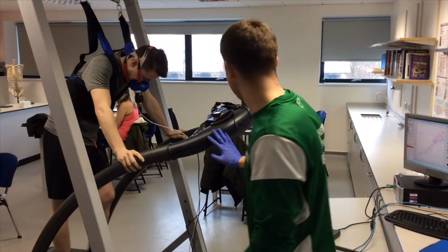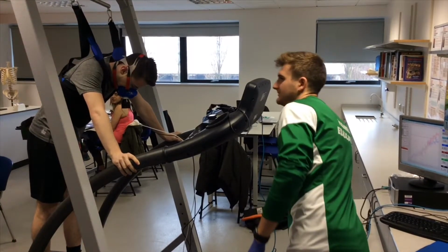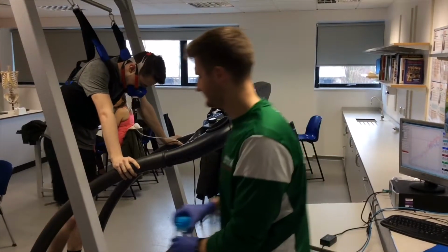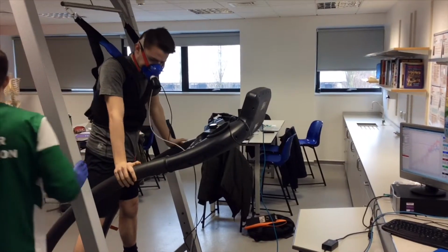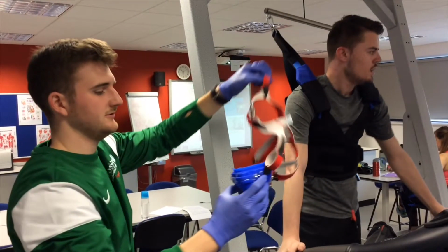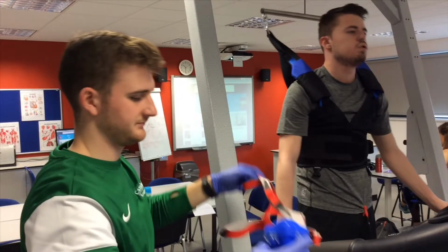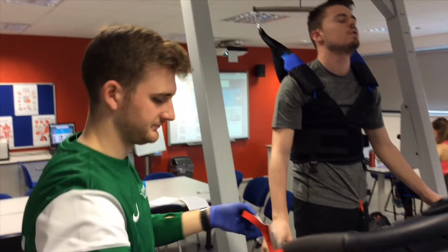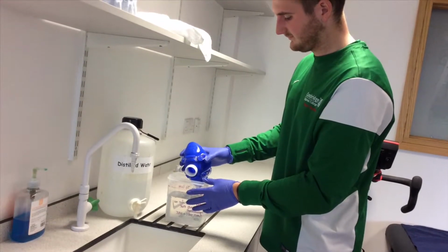After the test is complete, the lab tester removes the mask from the individual when it is safe to do so. This will be then sterilised because all equipment used when testing must be adequately sterilised after use. Coombs and Skinner, 2014. This is the lab tester sterilising the mask.